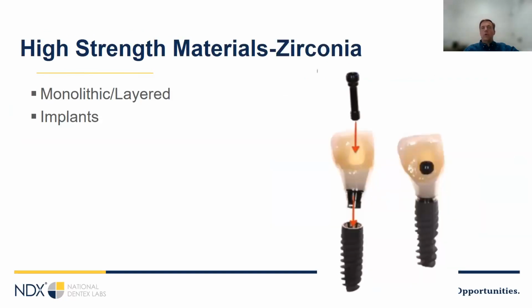So I would say zirconia, we all do a lot of zirconia. It's an awesome high strength material. Full contour zirconia is getting prettier and prettier, so I think we can come further and further forward with it. One of the things we have to think about, though, is when we change materials, there's usually a visible transition. Even if the colors match perfectly on the bench, the difference in optical properties can be noticeable.